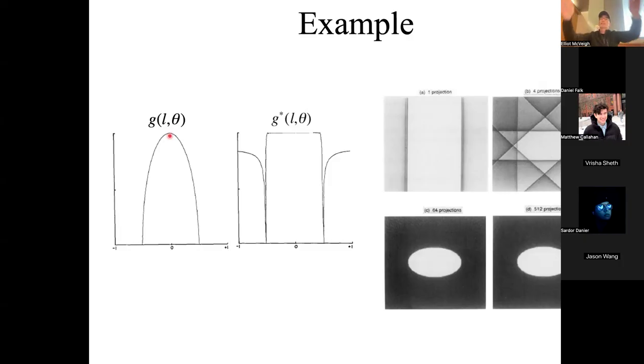And so it just goes down like this. So it's not the object. It's an inaccurate representation of the object. But when we do this convolution back projection, we do the convolution first. It gives me a flat top. It's a single example of how it's more accurately representing an object, in this case, say a disk, right?